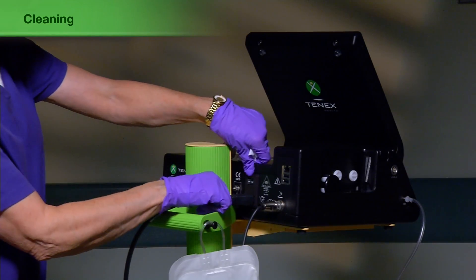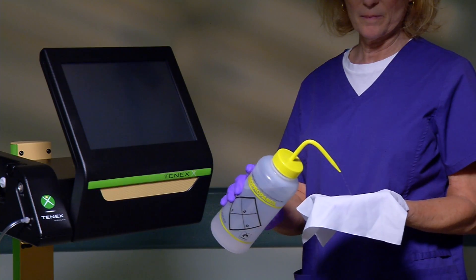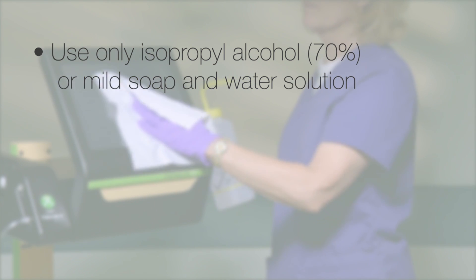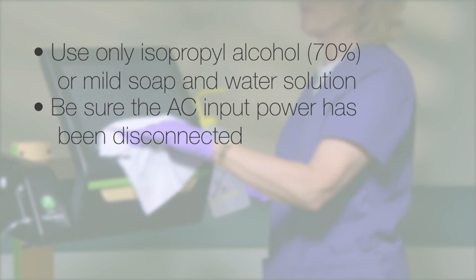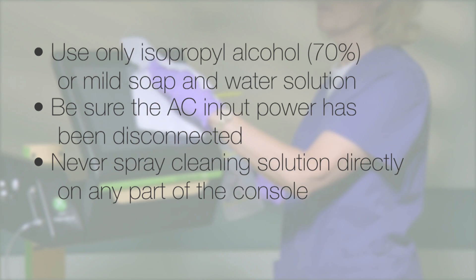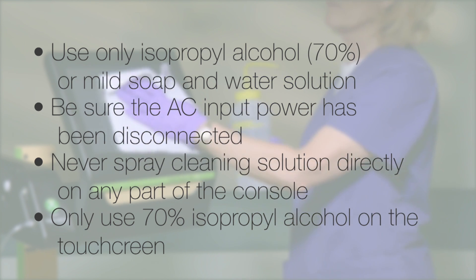Before cleaning the console, be sure that the AC power input has been disconnected. When cleaning any external surface on the console, use only isopropyl alcohol 70% or a mild soap and water solution and a soft cloth. Do not use bleach or corrosive solutions. Never spray cleaning solution directly on any part of the console. Use only 70% isopropyl alcohol to remove soil from the touch screen.